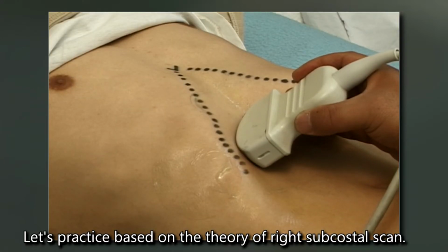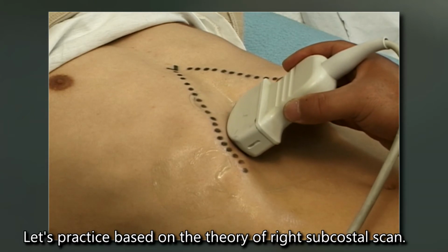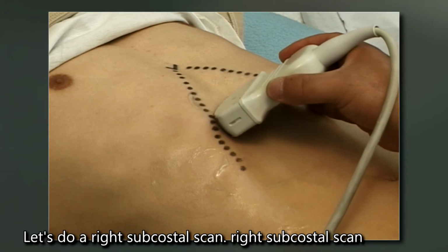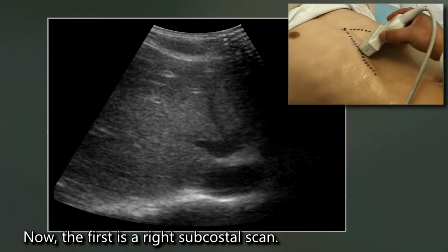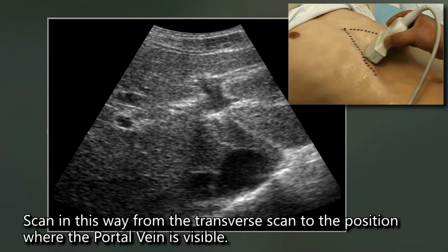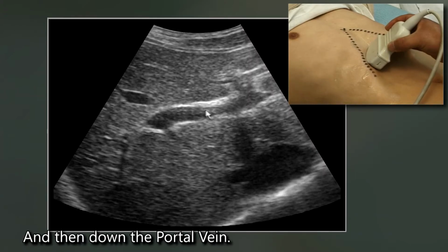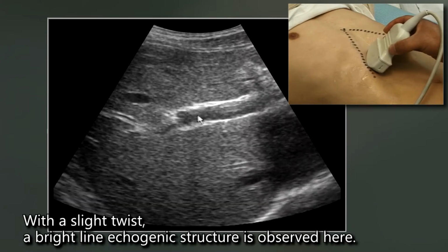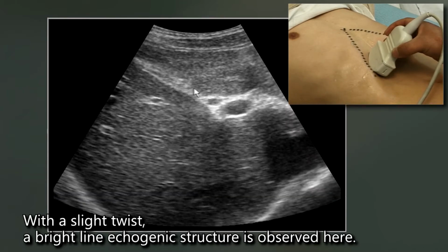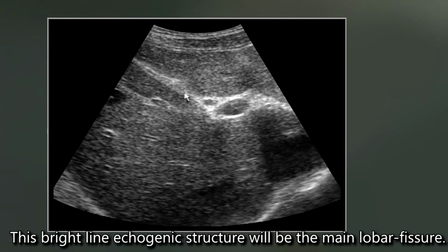Let's practice based on the theory of right subcostal scan. Let's do a right subcostal scan. Now, let's start with the probe as the center. Scan in this way from the transverse scan to the position where the portal vein is visible. And then down the portal vein, with a slight twist, a bright line echogenic structure is observed here. This bright line echogenic structure will be the main lobar fissure.